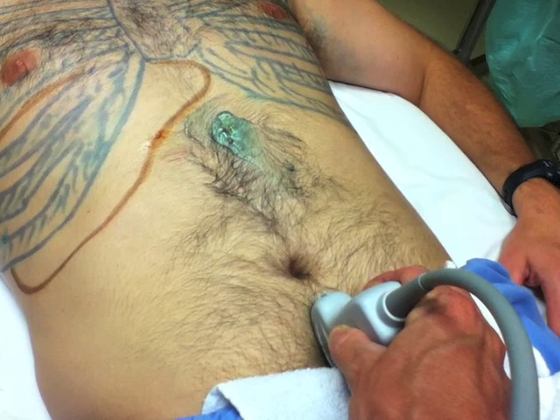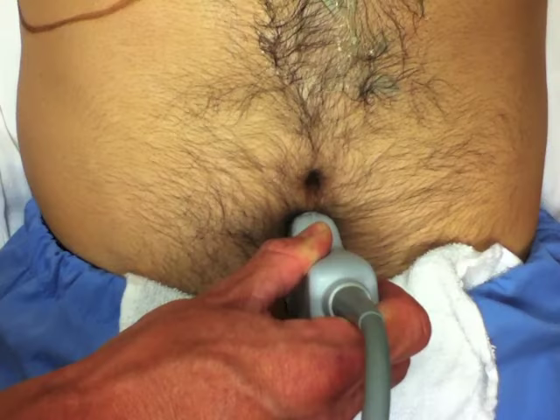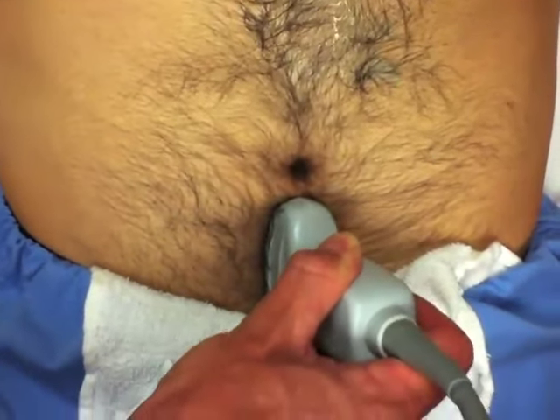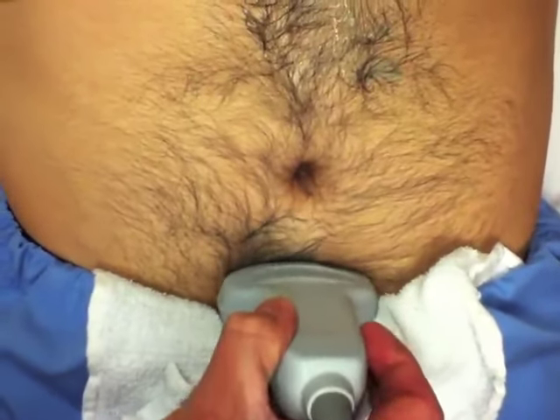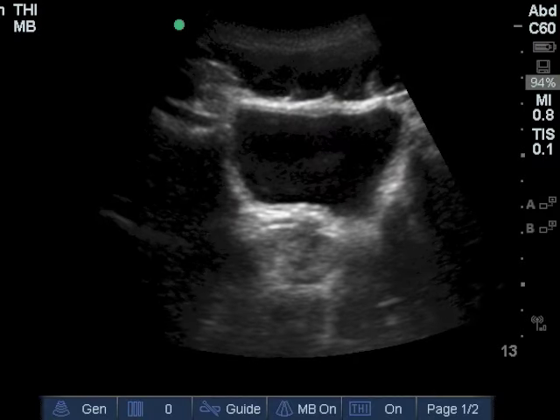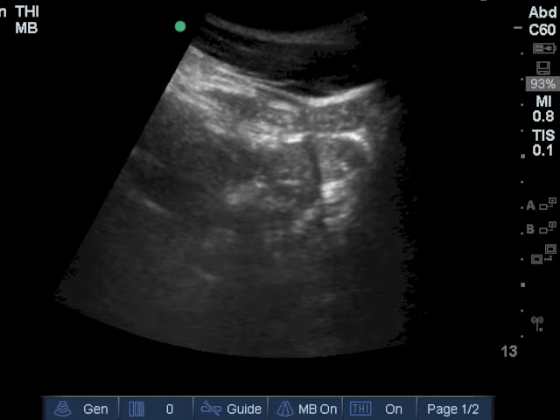The pelvis is the easiest view to obtain. Place the probe just above the pubic symphysis and tilt it down into the pelvis. Start in the sagittal up-down plane, fan left and right, then move to the transverse plane and tilt it. If there is any urine in the bladder, you will see it as a black circle or oval shape. If the bladder is empty, you will just see a bunch of echoes and shadows. Remember, you are looking for areas of irregular, dark, black free fluid outside of the bladder.